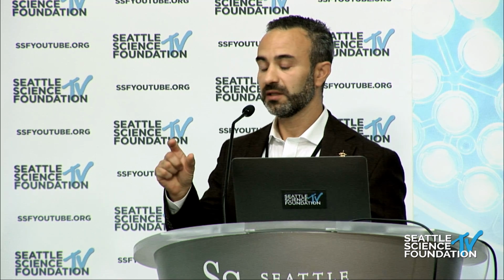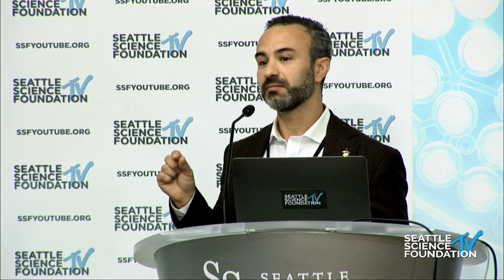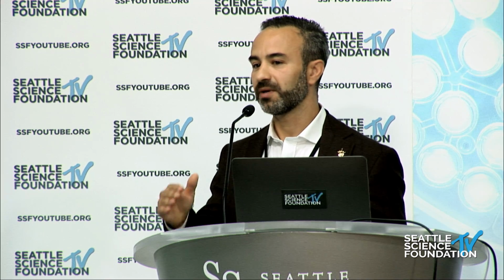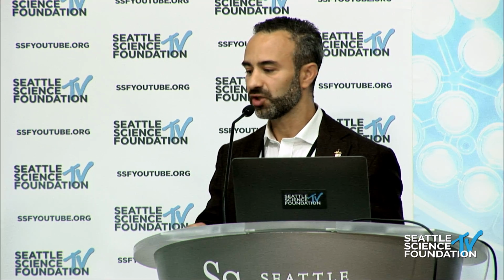But usually 20 to 25 degrees lordosis and about 6 to 8 millimeters of posterior height is what I shoot for. And again, I am looking at neuromonitoring. If there is any drop, I try to not have such a large anterior height. In general, not more than 20 or 22 millimeters of anterior height. I feel like that's where I start getting in trouble.